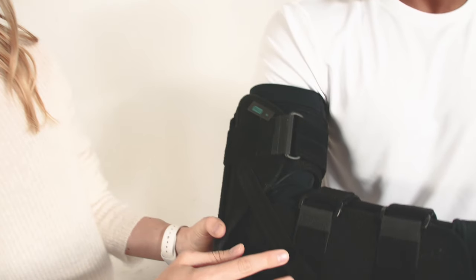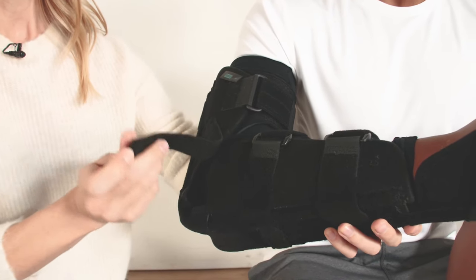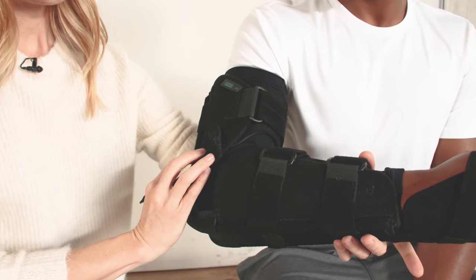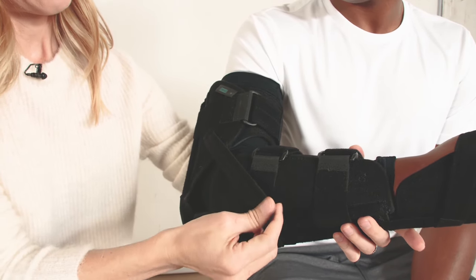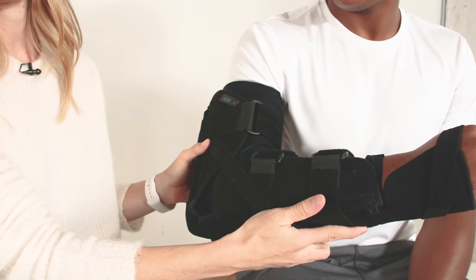We've included tensioning straps at the elbow which are located both laterally and medially, which give extra control to the support of the brace. Sometimes gravity will create a bit of a lag. By having these straps you can add extra tension and make sure that you have the support that you need.